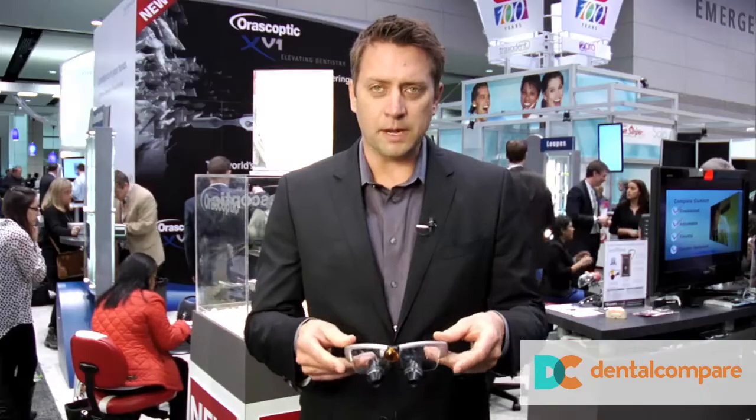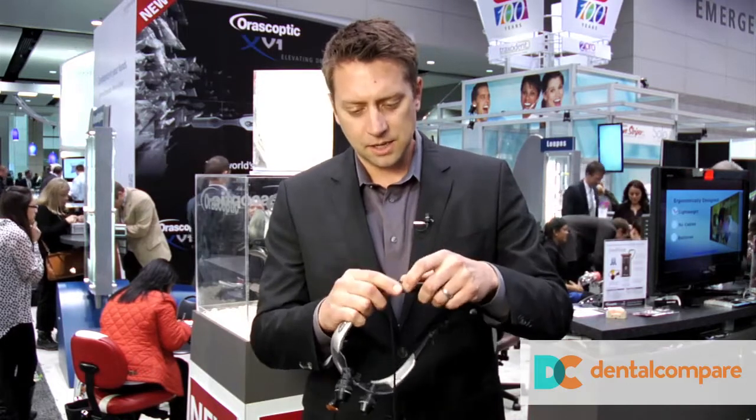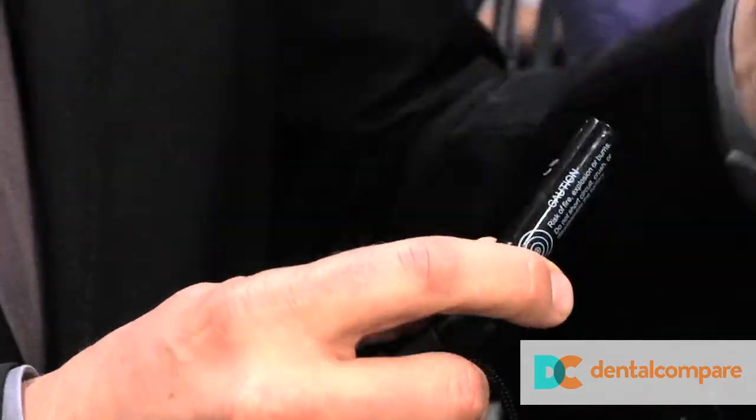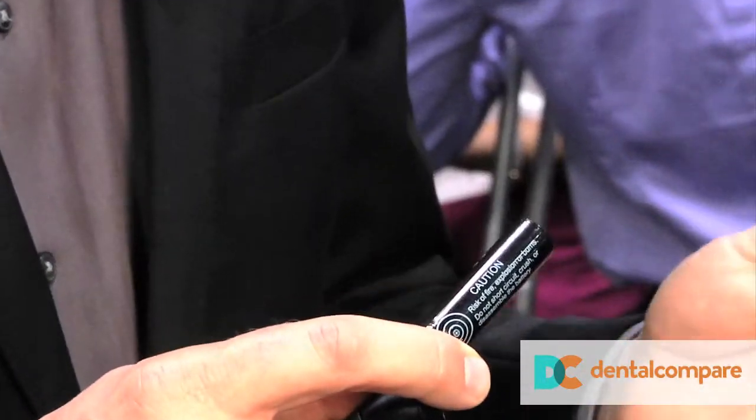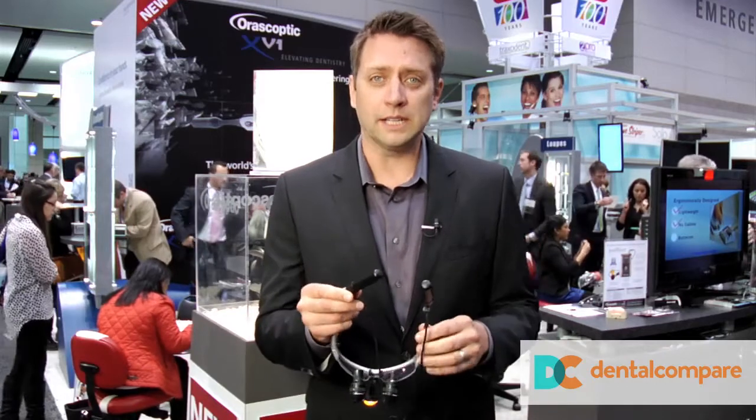Now, it adds a little bit more weight to it, but they're counterbalanced really nicely. On the battery side, you have rechargeable batteries. Each side gives you about one and a half to two and a half hours, so you can have these work for you all morning long and switch out the batteries for the afternoon.